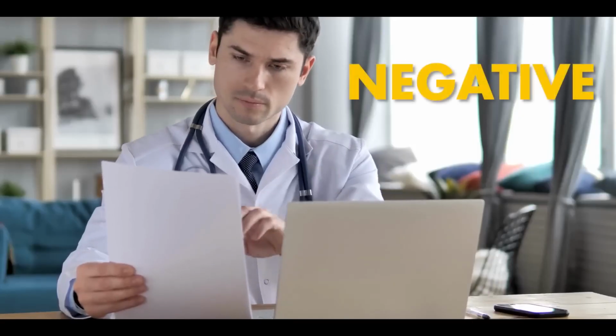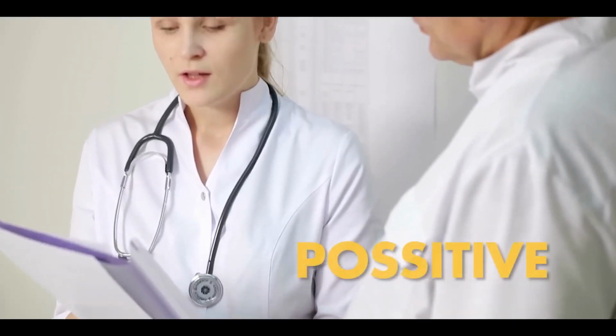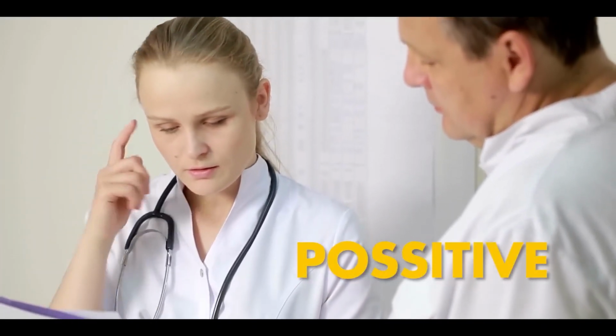If the cervical cells appear normal, the test reports are considered negative, and no further checkups are required. However, if abnormal cells are found, the test reports are considered positive. In such cases, the doctor will guide the patient for further steps and necessary treatments.